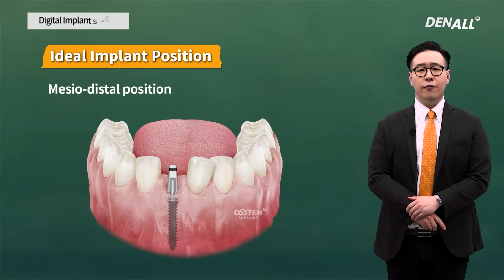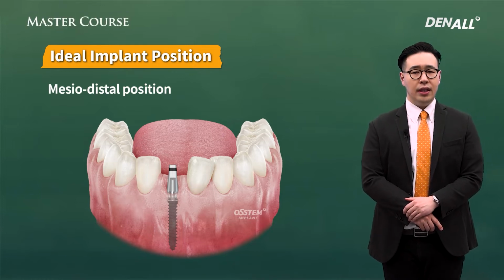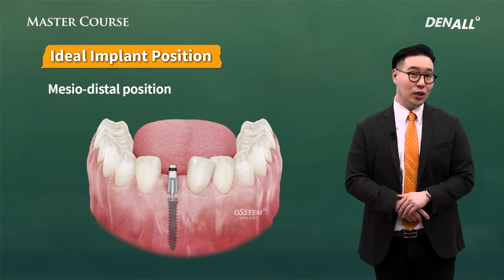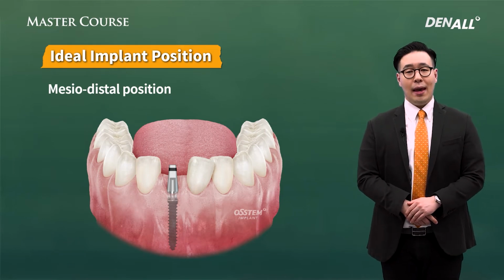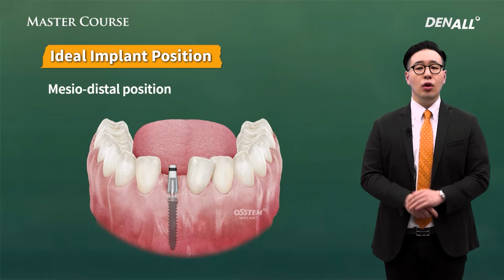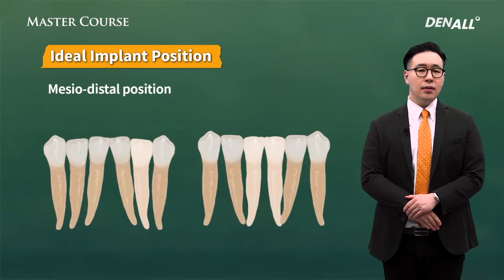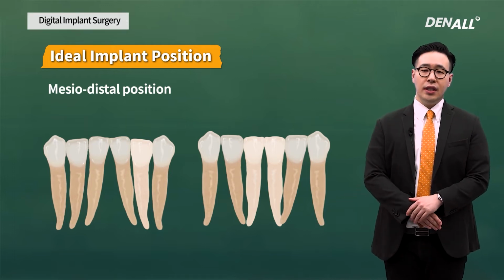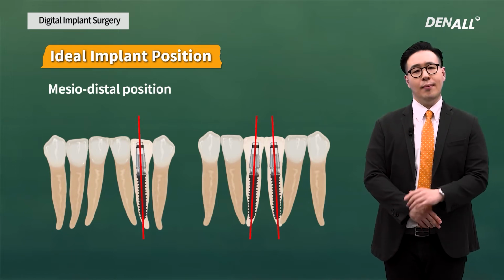At the lower anterior region, flap handling and implant placement should be done very carefully as the submental artery runs in the lingual side of the mandible. I use the MS implant. For the placement, I mostly use the one-guide system. As you can see, even when roots are bent or the axis of adjacent teeth is not favorable, I also use this as accurate placement is ensured.